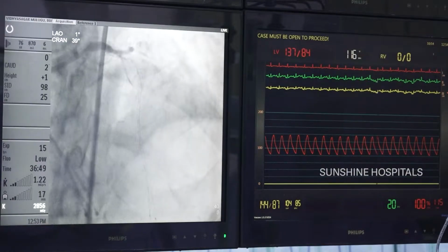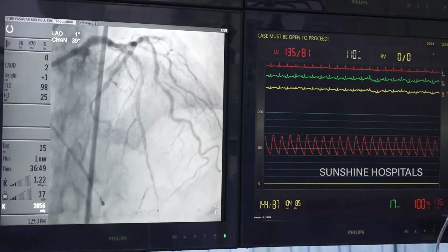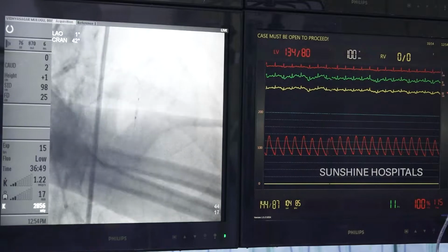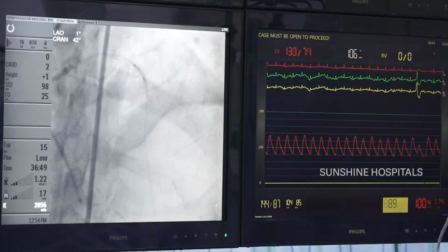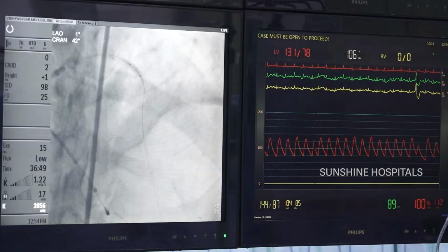The lesion was dilated with the 2 mm balloon, but because of the watermelon seed effect it was slipping, and we were unable to achieve adequate dilatation. You see, it's slipping, so we were unable to achieve any balloon dilatation with the 2 mm balloon.